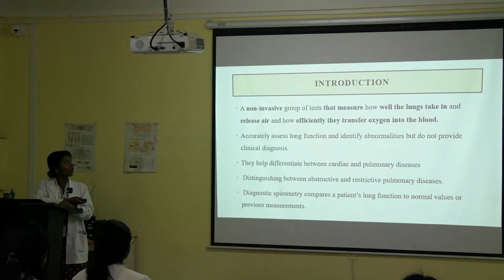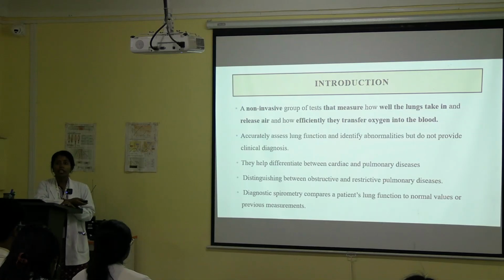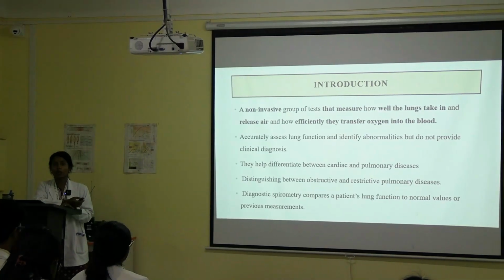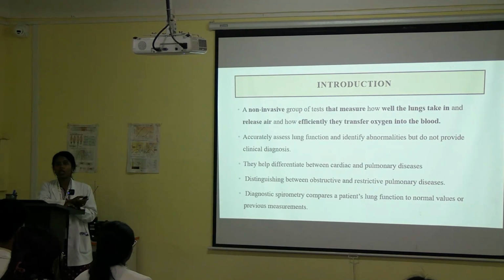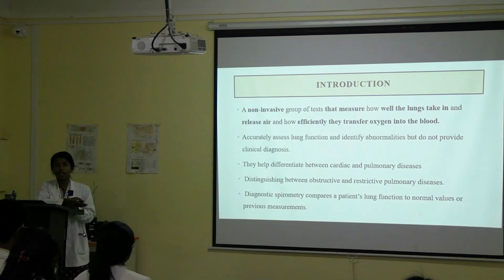So they assess the lung function and identify abnormalities but do not provide any clinical diagnosis. In this they will not tell you the exact cause, they will just give you an idea. Is it because of a lung cause or a cardiac cause?